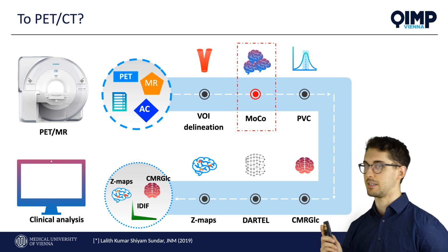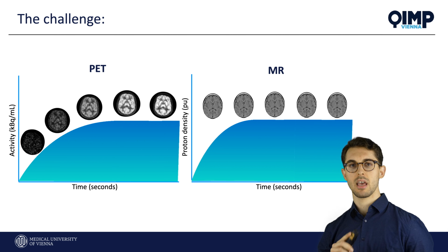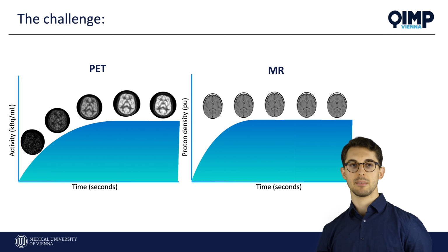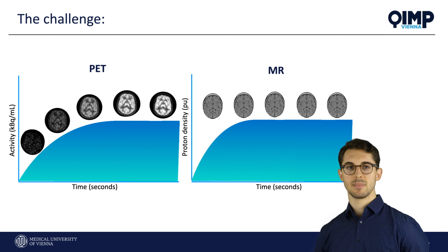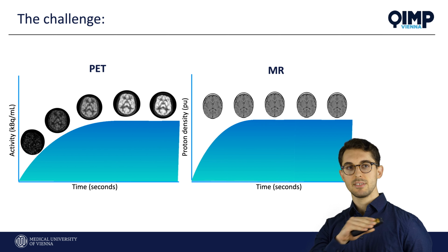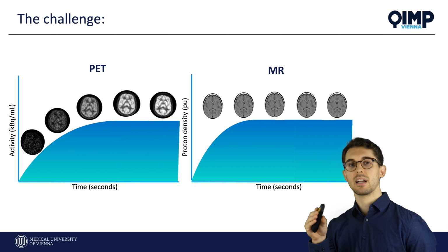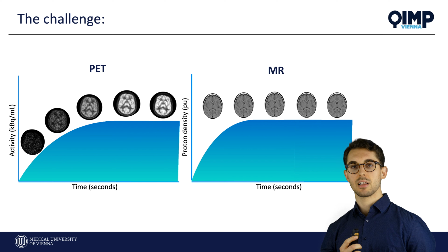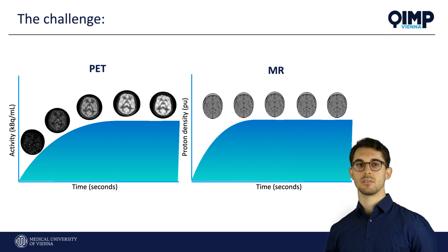Why? Let's see that. In an integrated PET-MR, sparse MR navigators are required to detect motion, and we can apply the motion vectors to align the PET images. In the PET-CT, we can only register directly the PET images at different time steps to compensate motion. But this will not work because, as you can see from the graphs, the activity distribution of the PET frames during the scanning is changing, while in MR navigators, image information does not change drastically during the protocol. Standard registration algorithms do not work if the images do not have enough structural and feature information. So how can we do that?